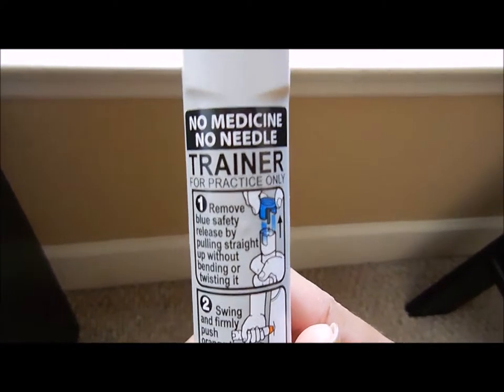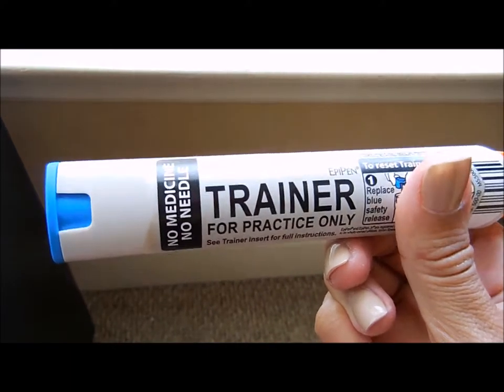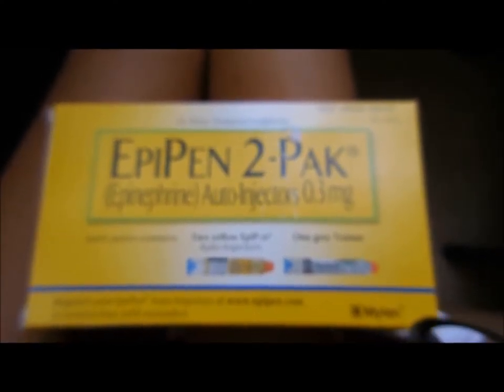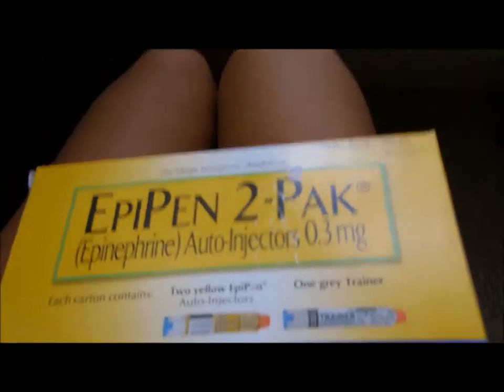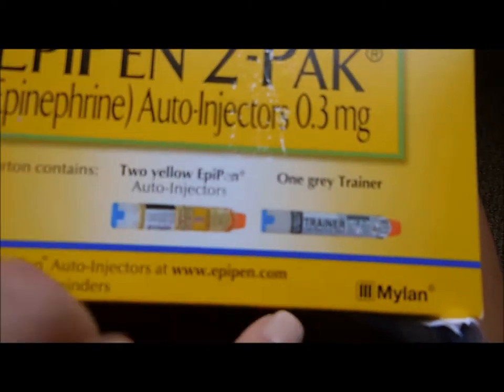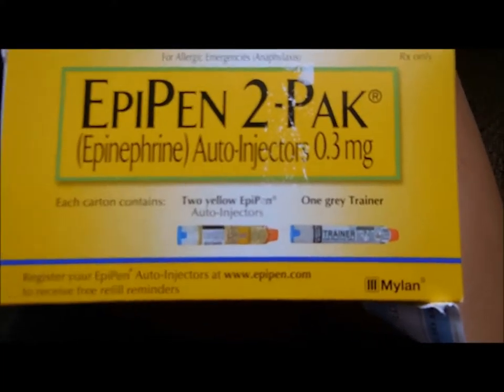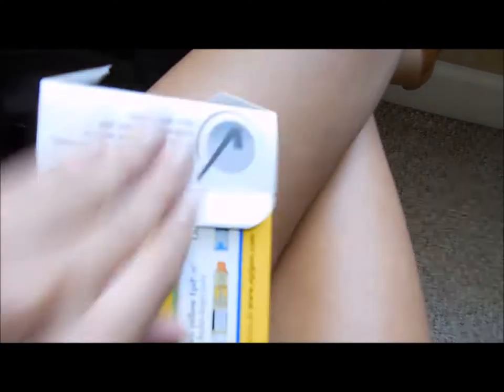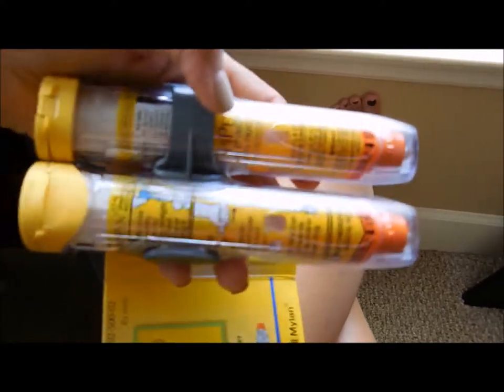I'm going to show you a real EpiPen first. This is what your EpiPen comes in. I got the two-pack and you can get it for free if you go to the website — it was originally 80 dollars but I got it for free. My legs are closed here but this is what the real EpiPen looks like.